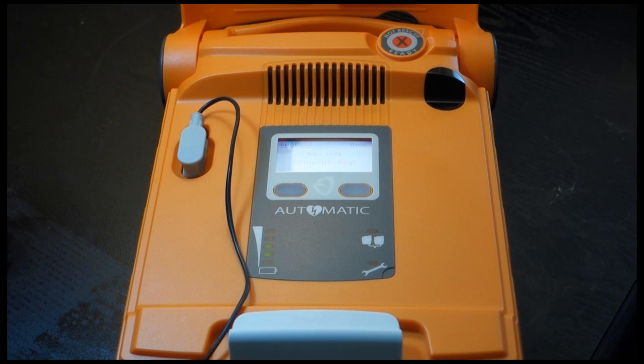It is now safe to touch the patient. Give 30 rapid compressions and 2 breaths as instructed. Place the heel of one hand on the center of the chest between the nipples. Place the heel of the other hand directly on top of the first hand.